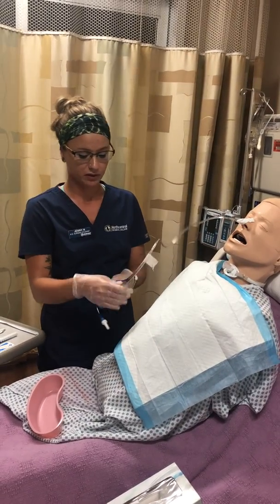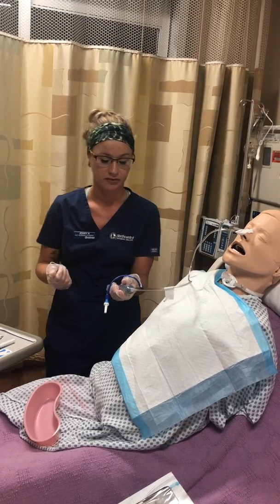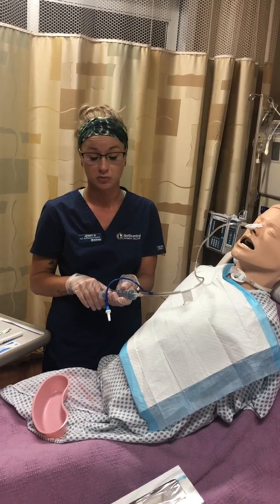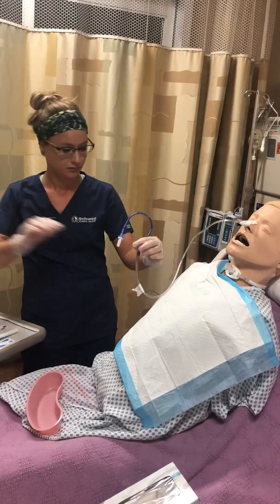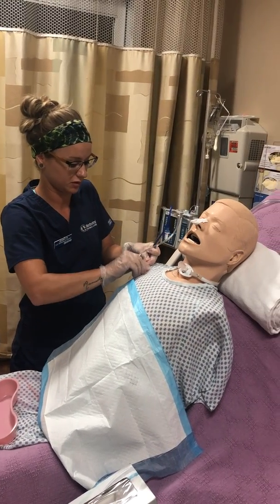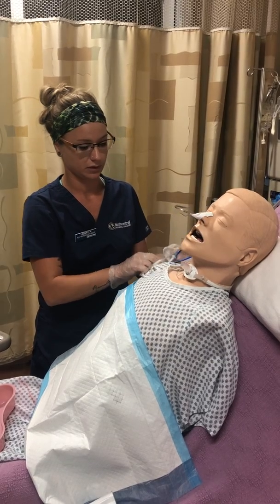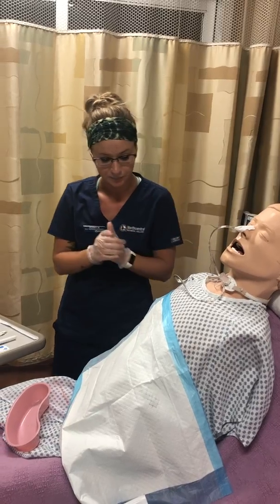Another way to confirm placement is to aspirate back the stomach contents and visualize the characteristics. You may have some litmus papers to test for the pH. The pH should be 5.5 or less, letting you know that it's in the stomach. It should be more acidic. So I'm going to disconnect my syringe here. Go ahead and attach it to her gown. Okay, and that should be suctioning okay.